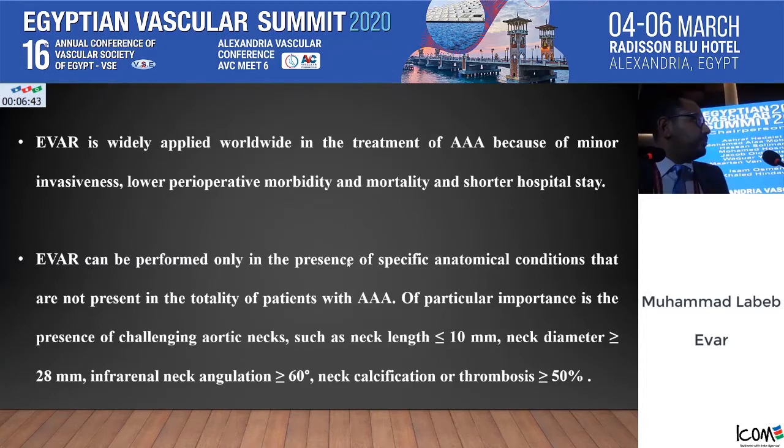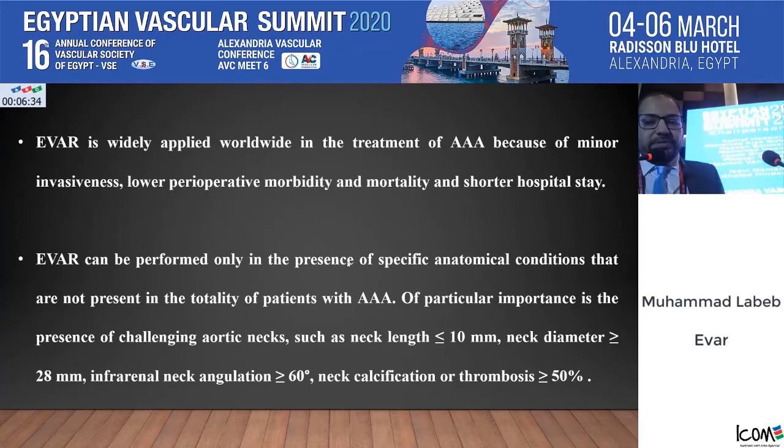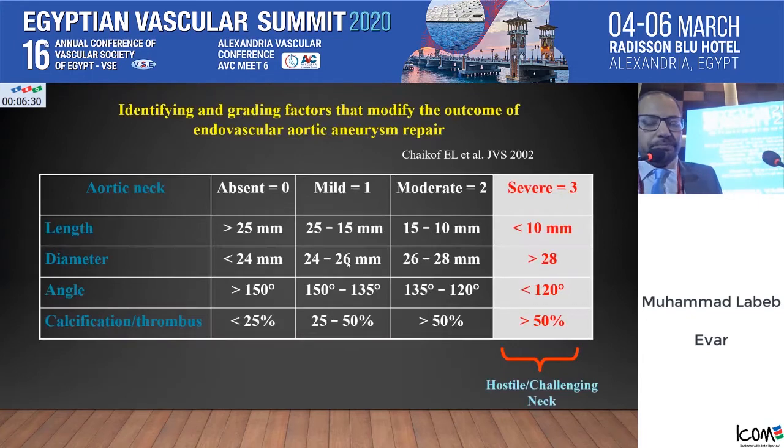EVAR is widely applied worldwide in the treatment of AAA because of minor invasiveness and lower perioperative morbidity and mortality. EVAR can be performed only in the presence of specific anatomical conditions that are not present in the total patient population.